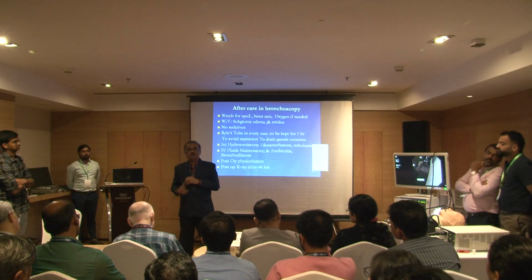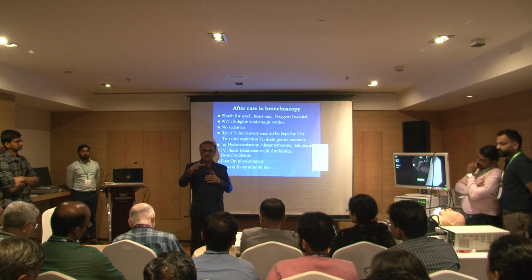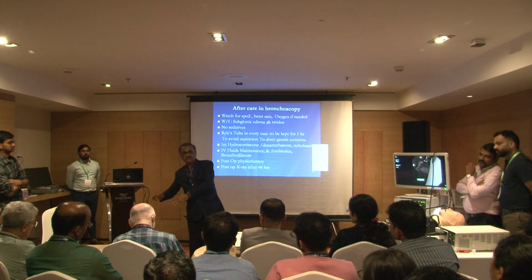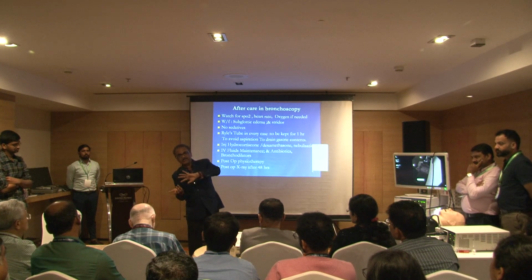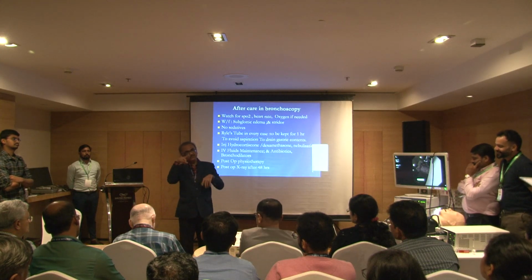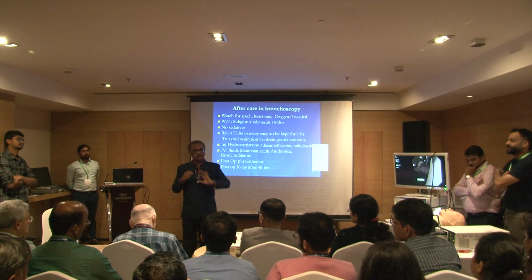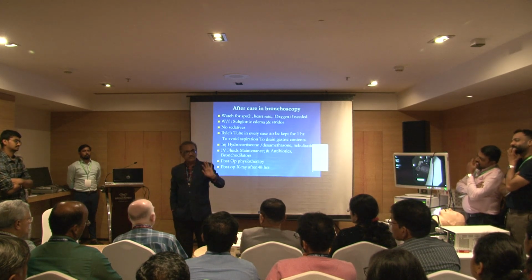So going on the right side is easy, straight you are going, because it's larger and shorter and straighter also. But going on the left, come to the carina, shift your chair to the right side, so that you are going to the left. Then shift the head slightly, turn to the right side. Have slight extension if you need, and then see that you never ever force the scope. It should always be under vision. Never ever force it in a blind way. Unless you are seeing distally, you are not going to insert it also.